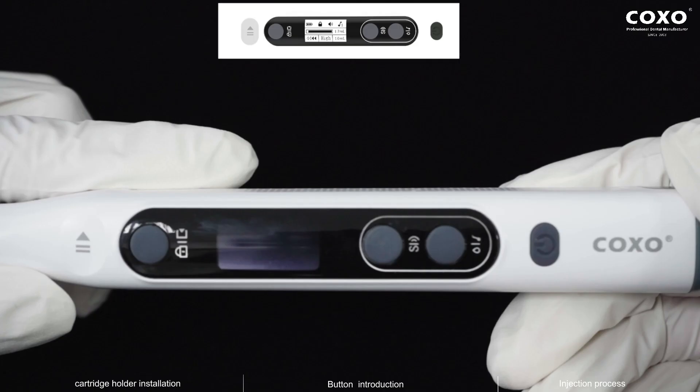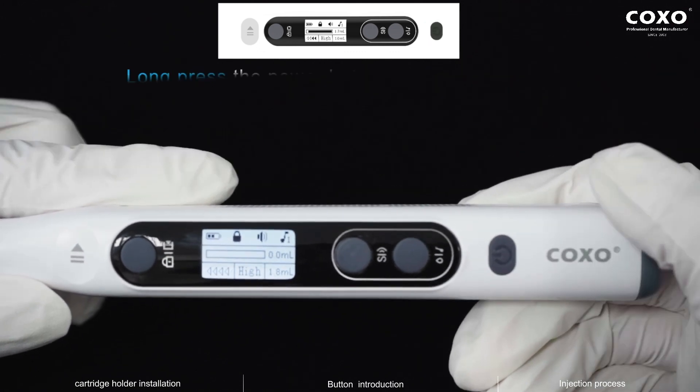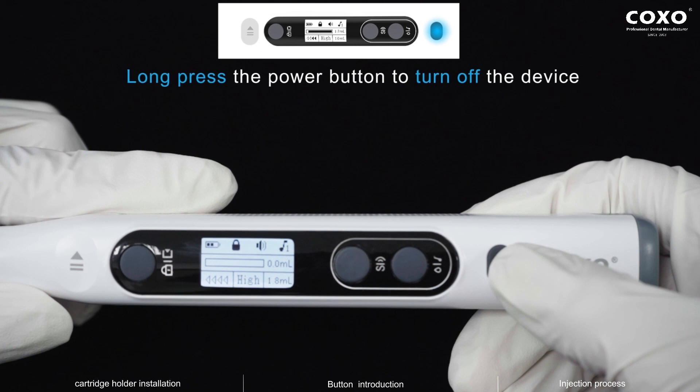Button Introduction. Short press the power button to turn on the device. Long press the power button to turn off the device.